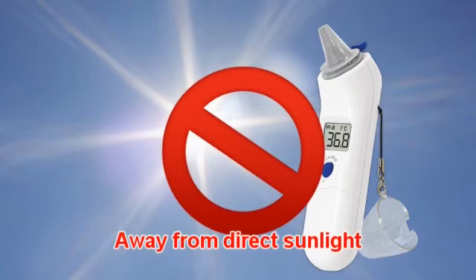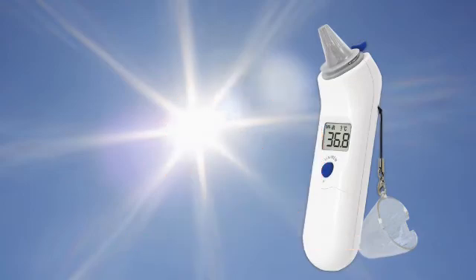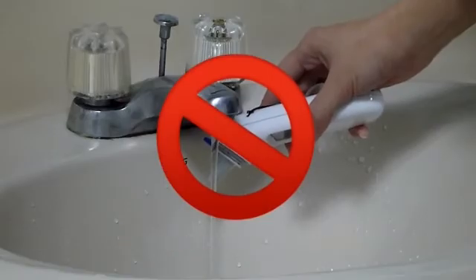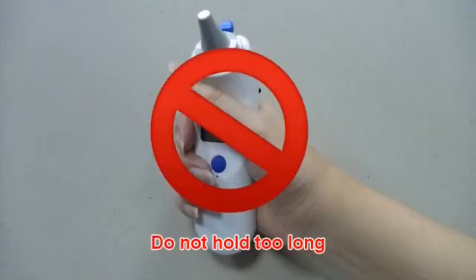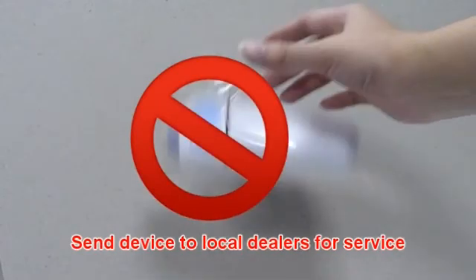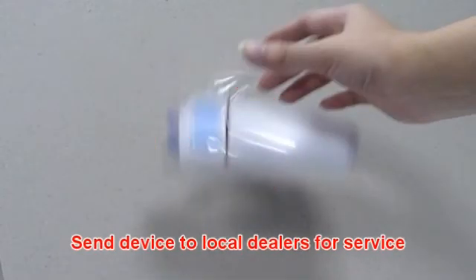Keep the unit dry and away from direct sunlight. Do not submerge the thermometer into any liquid. Holding the thermometer too long may cause a higher ambient temperature reading of the probe, which could make the measurement lower than usual. Please check if the device is damaged once it falls. If you cannot be sure, please send the device to your local dealer for service.